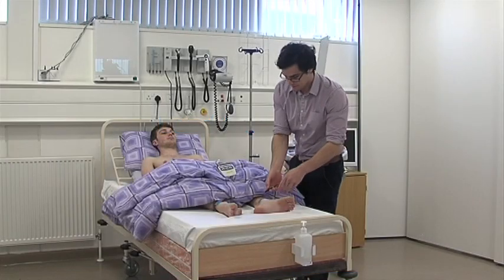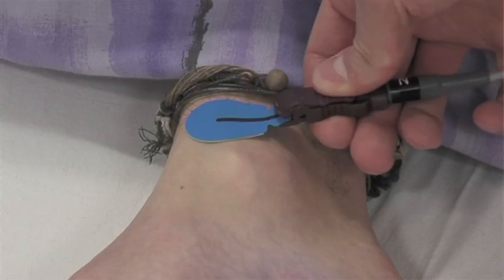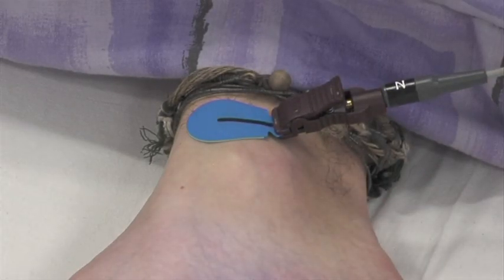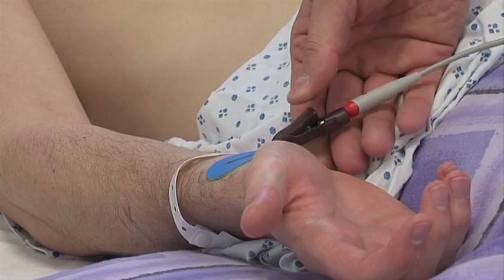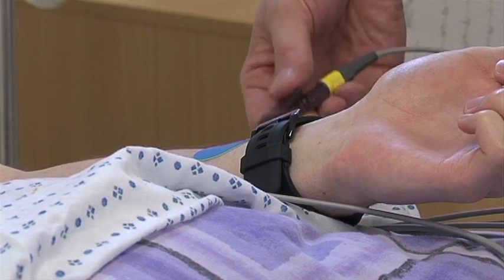The green lead should be attached to the left leg. The black lead should be attached to the right leg. The red lead should be attached to the right arm, and the yellow lead should be attached to the left arm.